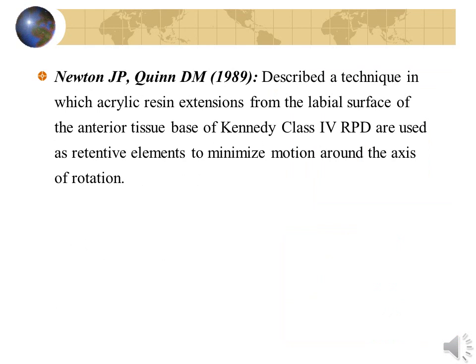Newton and Quinn in 1989 described a technique in which acrylic resin extensions from the labial surfaces of the anterior tissue base of Kennedy's Class 4 RPD are used as retentive elements to minimize motion around the axis of rotation. The labial rests formed by extending the base material act as guiding planes and also improve aesthetics by covering the interdental spaces.